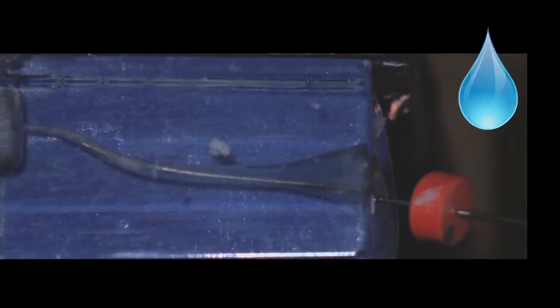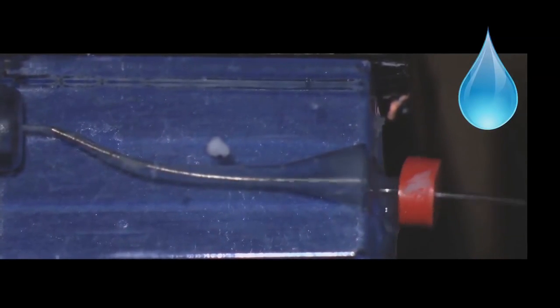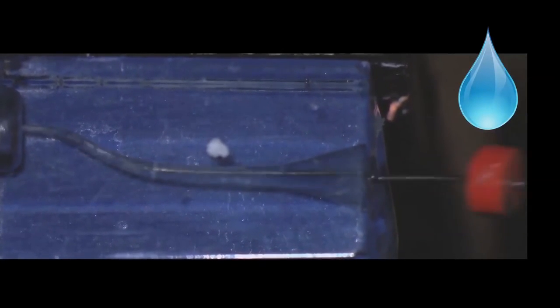Always the needle has to be loose in the canal. It can never ever be lodged inside the canal. We irrigate. Once again, we will ascertain that we have not blocked ourselves with the very small instrument that we established working length.